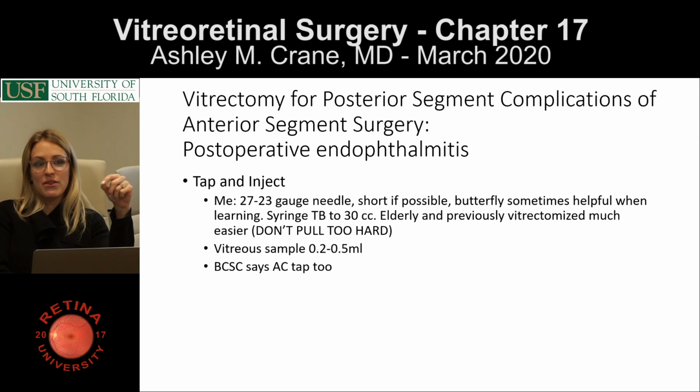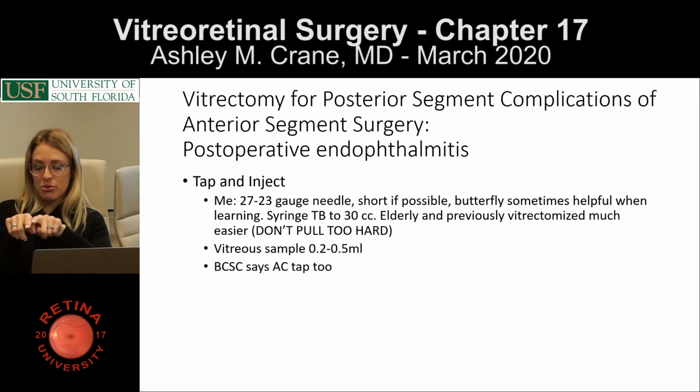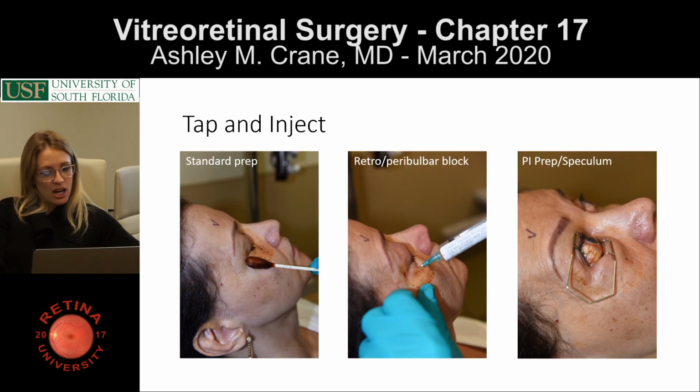One good thing, if you're doing this on a pseudophakic patient, I find it's much easier. Obviously, you're not trying to avoid the lens, and you can retro illuminate. You can just have a pen light and shine it right through the pupil, and you can see your needle. And if you can get it right up behind the IOL, there's a space there that is, I think, much easier to get the vitreous, and it's also pretty safe because you know exactly where you are. So I used to do that.